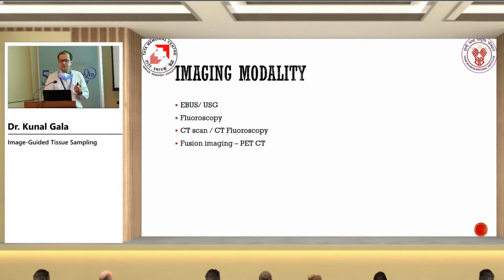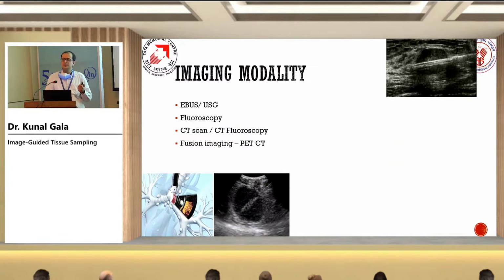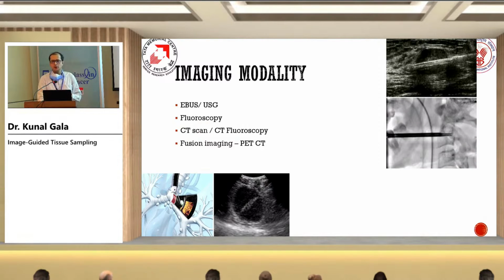And coming on to different imaging modalities, first is ultrasound guided biopsy. This is a conventional ultrasound. If there's a neck node, obviously we can target that much better. Pleural thickening can be targeted with the ultrasound procedure. Whenever it is mediastinal lymph nodes, it is done generally for staging. Then we can target either with FNAC or FNAB, depending on case-to-case basis. Third is a fluoroscopy guided biopsy.